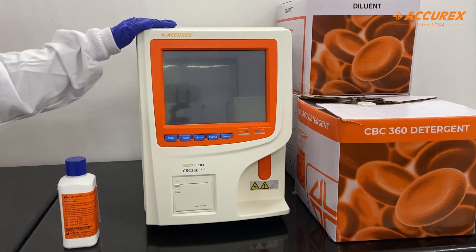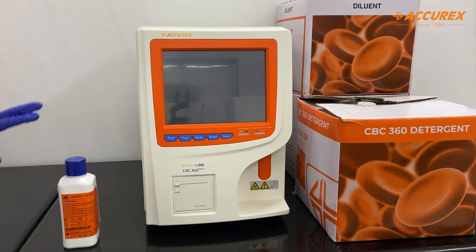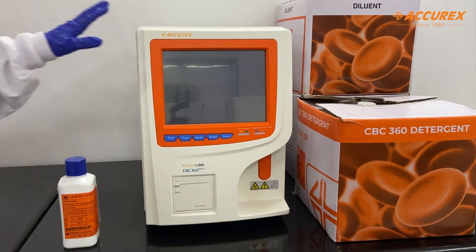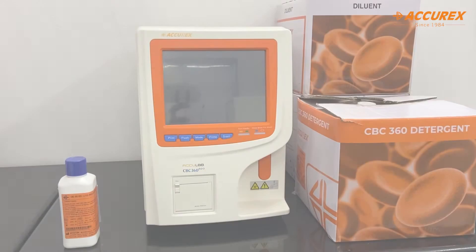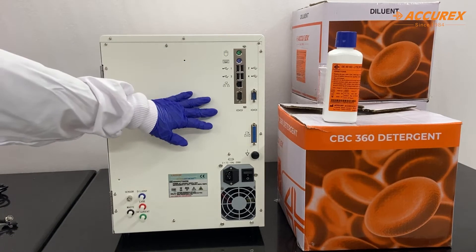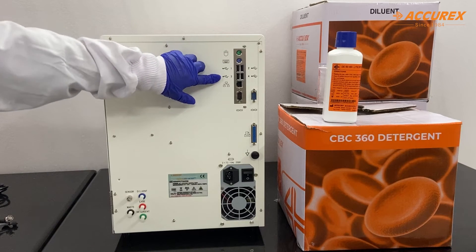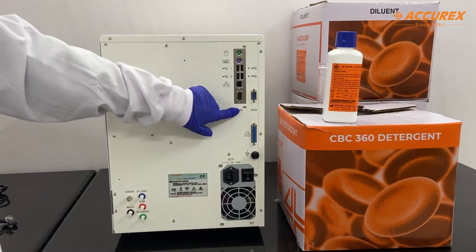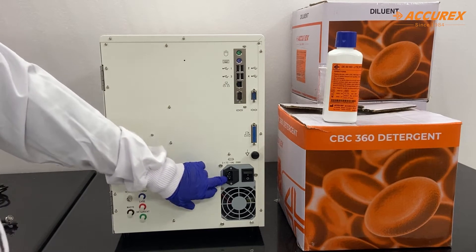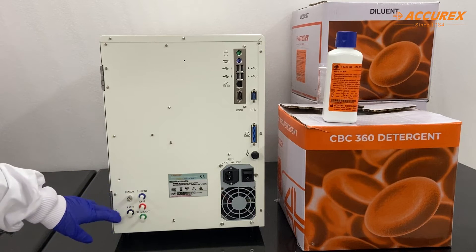Before we start the analyzer, we will first connect it to the reagents. We have three different reagents: lytic reagent, detergent, and diluent, and we will also give power supply to this analyzer. This is the back side of the analyzer. Here you can see different ports — the first two are to connect the mouse and keyboard, there are four USB ports, one LAN connection, and a port for the RS232 cable. Here you can insert the power cord, and these are for diluent, lyse, detergent, and waste connectors.